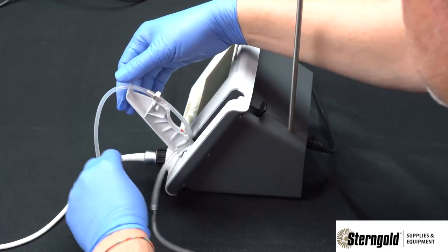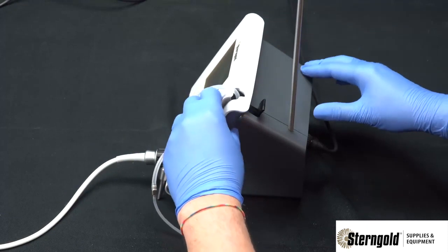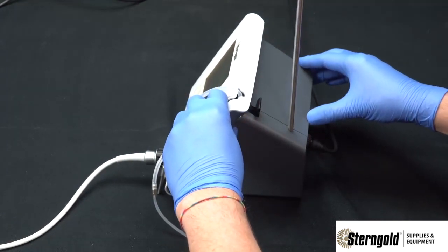Bend the tubing around so it comes out the slot at the bottom of the pump door. Once it's loaded, firmly press the door closed until the latching mechanism engages.